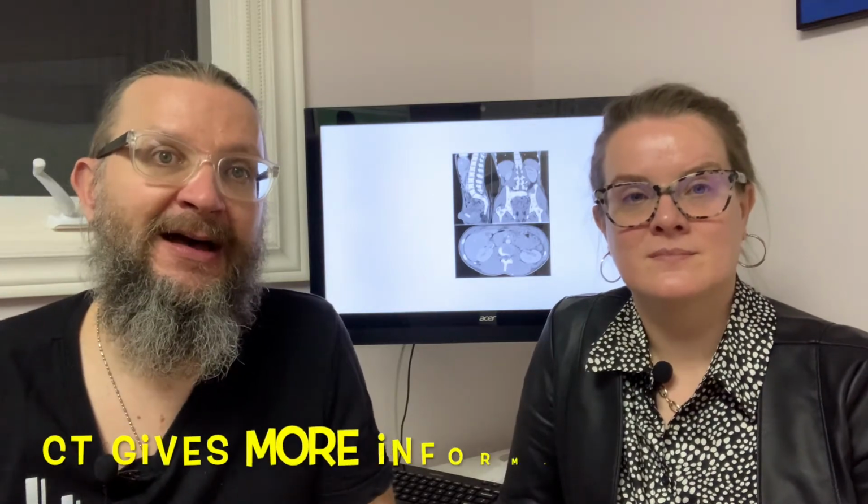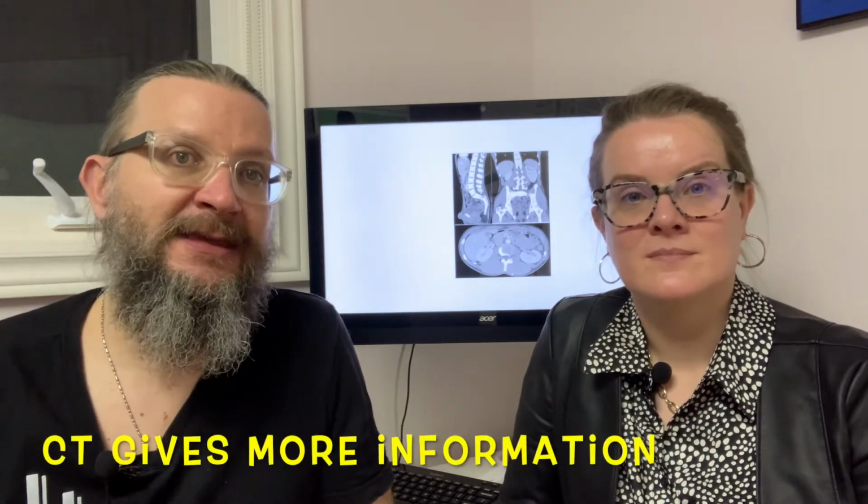Yeah. So because of that, you get more detail than you would with an X-ray. You get to see some bone. You do see some soft tissue. You get to see some organs. You get to see a lot of different things with it because of the amount of information that they're able to gather by having this thing continually go around you.